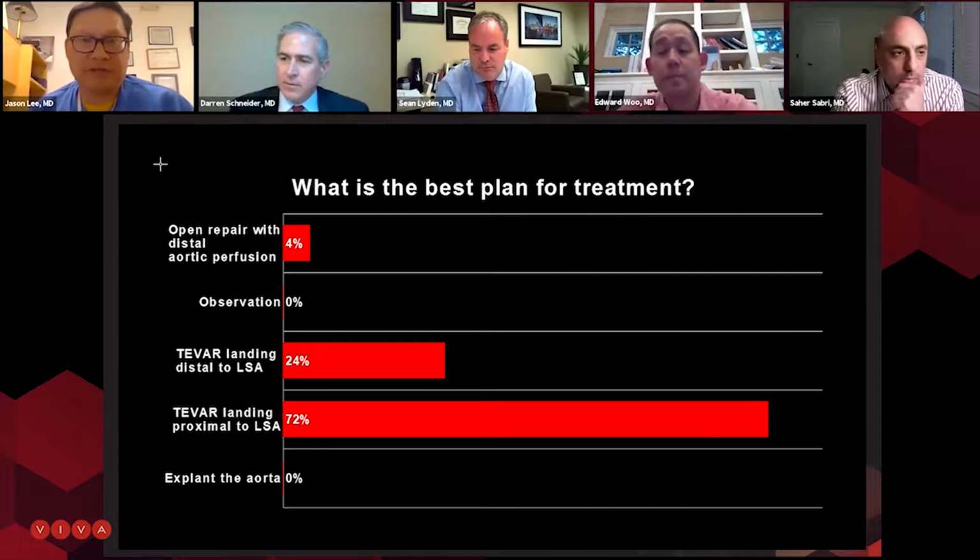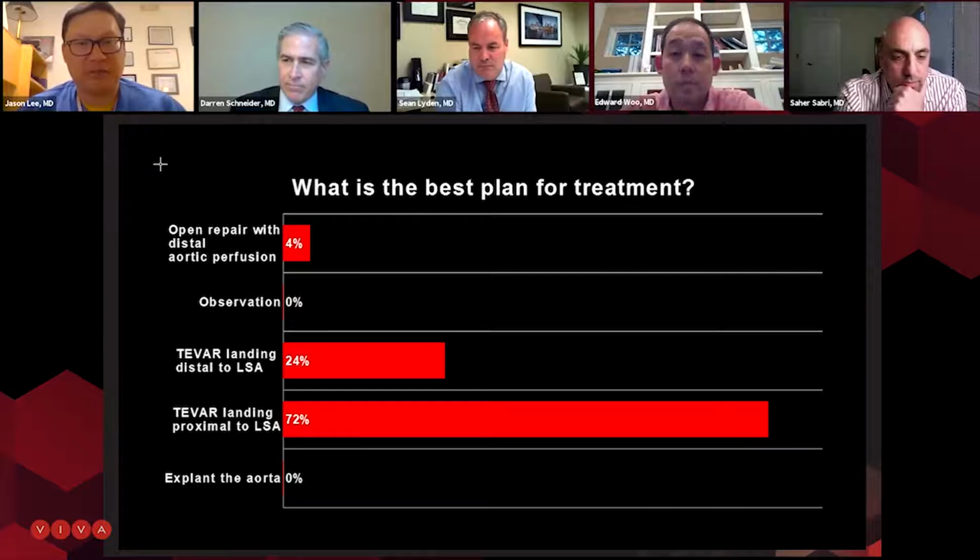I think the other tough thing is related to the fact that now that it's chronic, then clearly persistent false lumen expansion would be typically the main reason to intervene. And just based on the imaging, Ed, the distal landing zone's going to require some creativity to get a seal distally, I think.